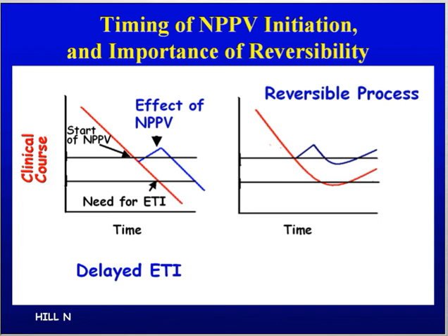Probably in part because first you see immediately the effect, which is obvious. Second, maybe because all intensivists know that intubation is a risky job, and therefore being able to avoid this, I think, is very easy to accept. But it's an interesting philosophical question, I think.